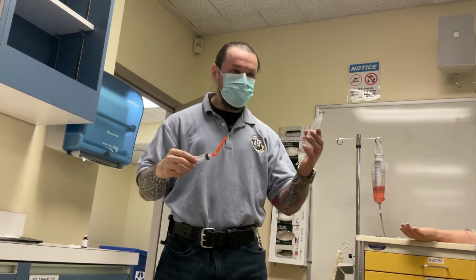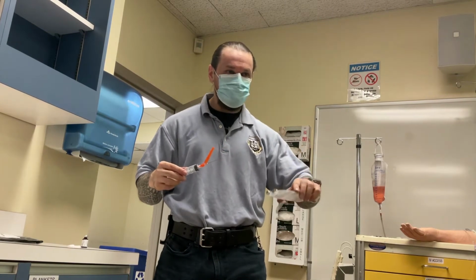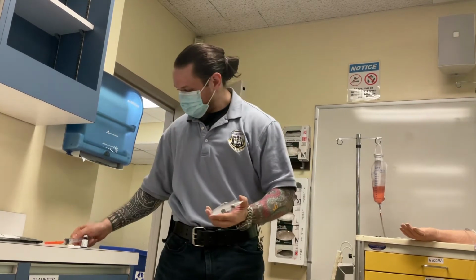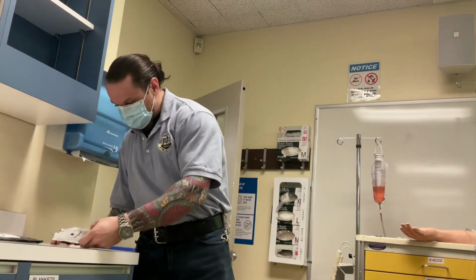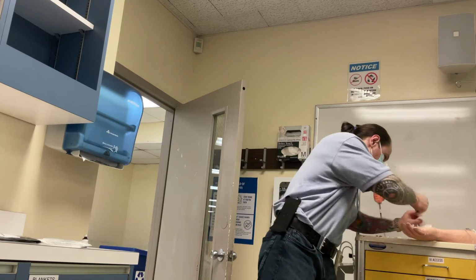patient. The next thing I do is don't do this. I'm going to do this in order to gently mix it. This goes in the sharps, right? And then ideally you want to have a label where you write your medications, whatever it is, right?